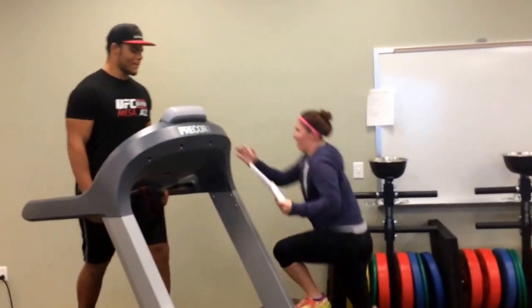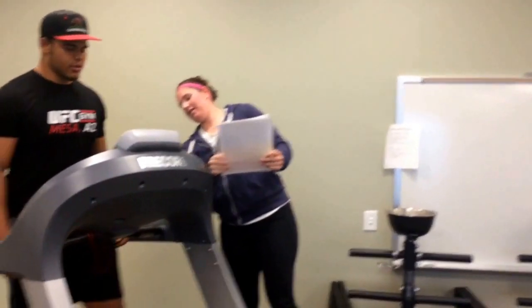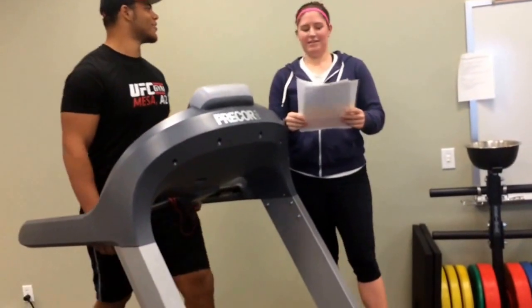So right now we are at the end of the second minute. Kenny, what is your heart rate? His heart rate is 99.